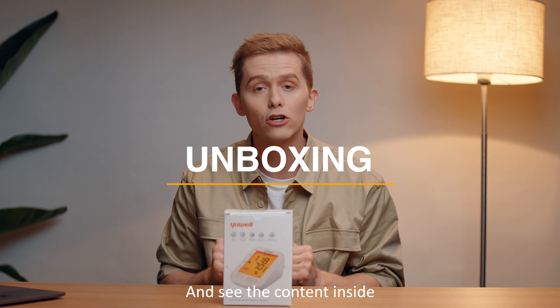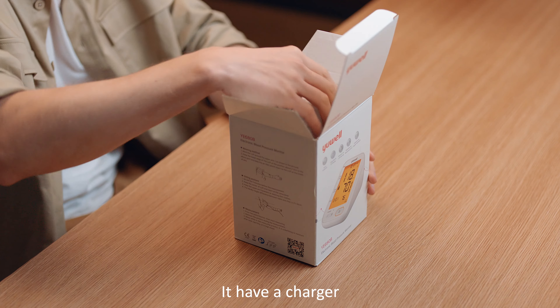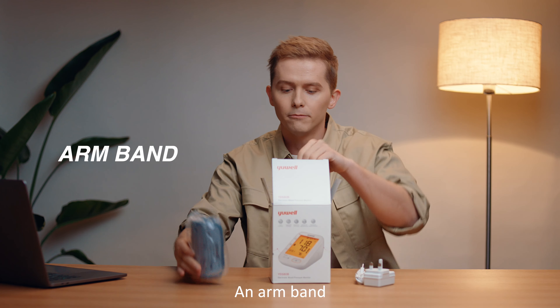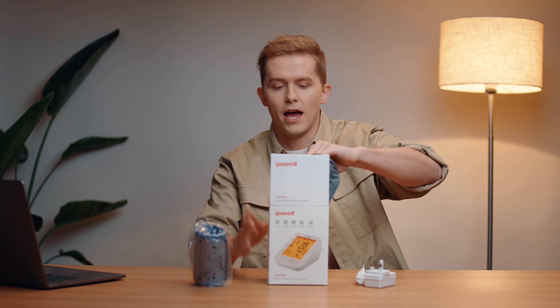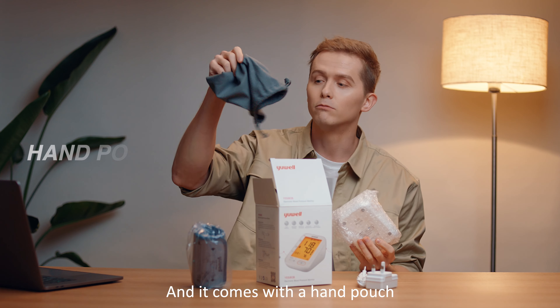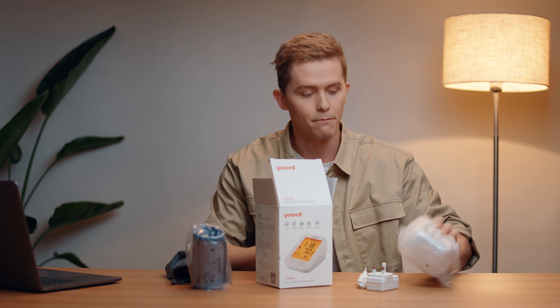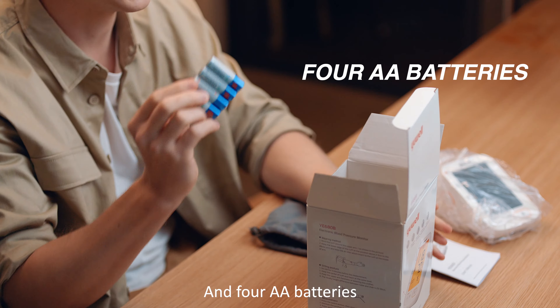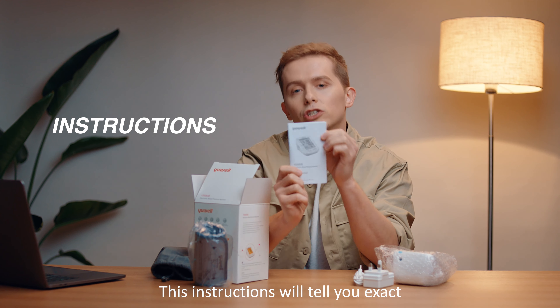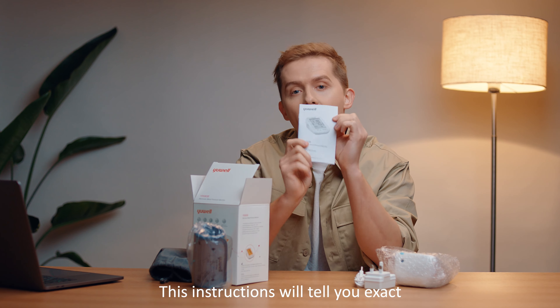Let's go ahead and open up the box and see the contents inside. There is the charger, the armband, and the electronic blood pressure monitor itself. It comes in this handy little pouch, with bubble wrap of course, and four double-A batteries and the instructions.